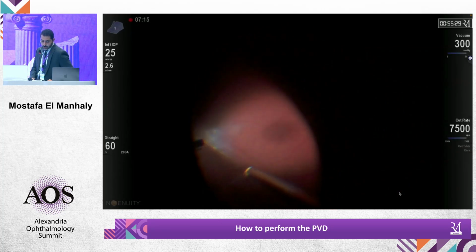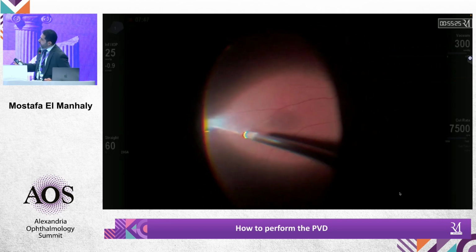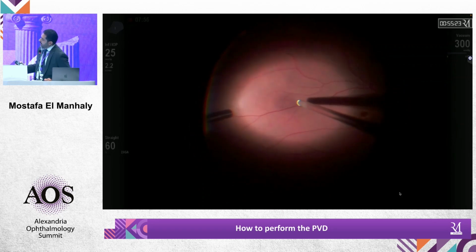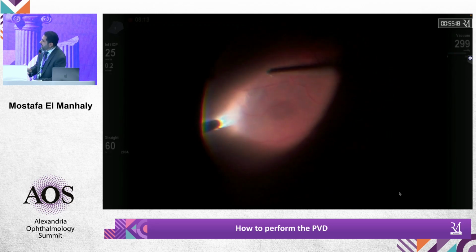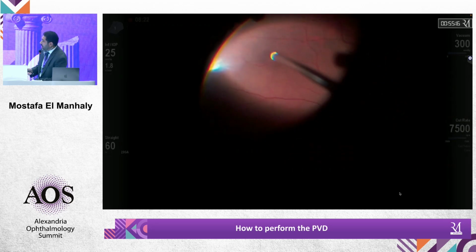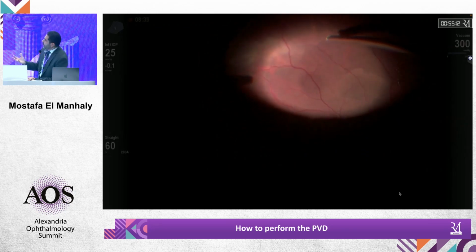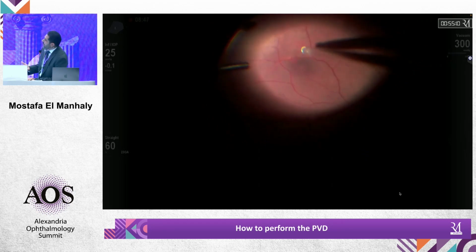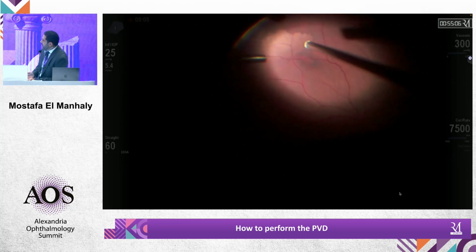Dr. Hassan, do you propagate the wave at once or gradually at different quadrants? So you start some part at the nasal part and then you propagate it superiorly. I mean, do you propagate the wave all at once, or you try to do it gradually so you can look where the wave is propagating?